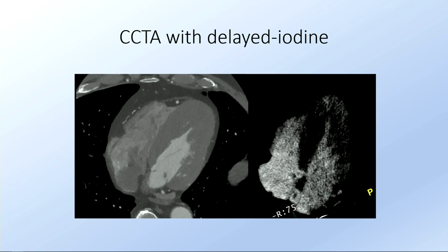So what's the diagnosis? We know the patient went then afterwards for a CT. As you can see here, the patient has apical hypertrophic cardiomyopathy, and you can see with the delayed iodine, the concentration of iodine mostly in the area that is more hypertrophied. So I think in these patients with cardiomyopathy also delayed iodine can be of use. It's still a decision when to do delayed iodine, when to plan it, when not to plan it, so you need to know a little bit better of the patient and the indication in order to decide. We don't do it for every single patient, obviously.